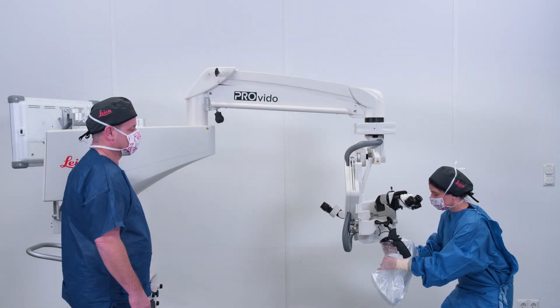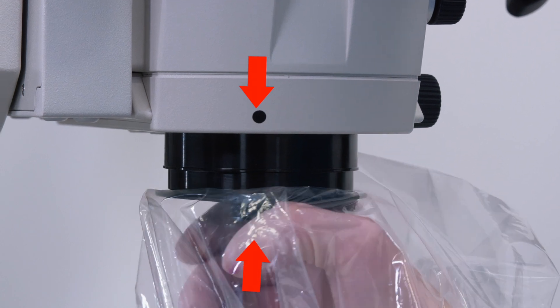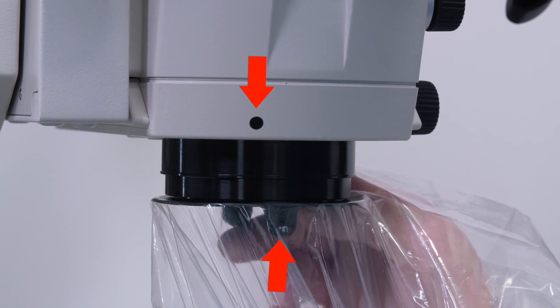Match the white dot on the lens cover with the black dot on the microscope and twist to the right until you feel it is secure and locked into place.